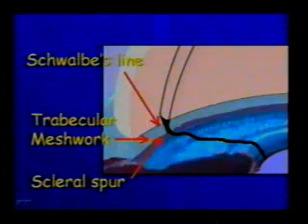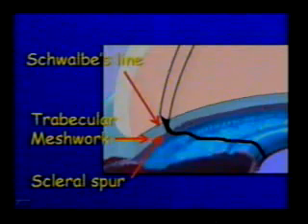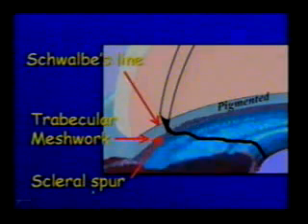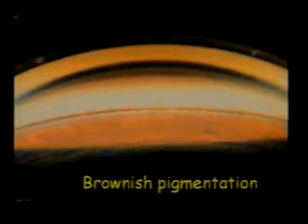The light will continue along the angle recess, then the root of the iris — this is the angle of the anterior chamber. You can see it here: this is the iris, this is the ciliary recess, and here is the trabecular area. This is Schwalbe's line anteriorly, and this is the scleral spur — previously called the posterior Schwalbe's line. Schwalbe's line is the meeting point of the external and internal lights. The trabecular meshwork is slightly pigmented, and then there is a whitish band which is the scleral spur.